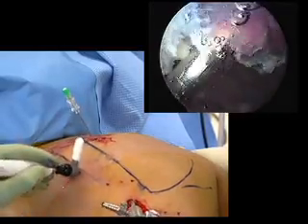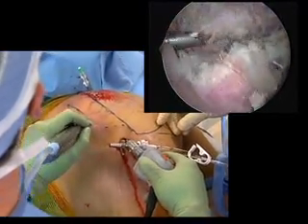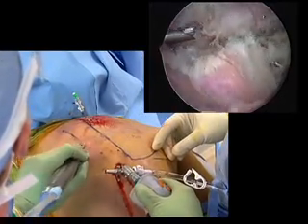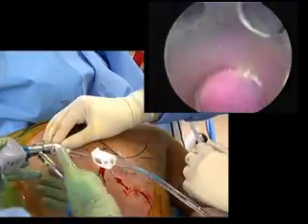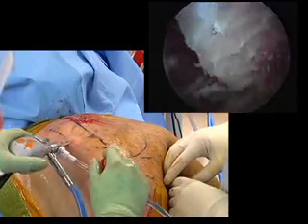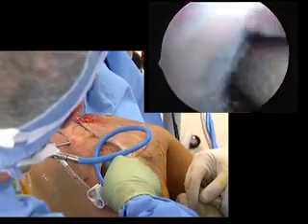A high-speed motorized burr is used to resect the supramedial angle. The resection is performed similarly to an arthroscopic acromioplasty with approximately 20 by 20 millimeters removed, and the resection is viewed from both portals to ensure adequacy of resection. The bone is typically thin, and a rasp may be used to contour to a smooth, stable, and flat margin. The arm is then brought through range of motion to assess the resection.